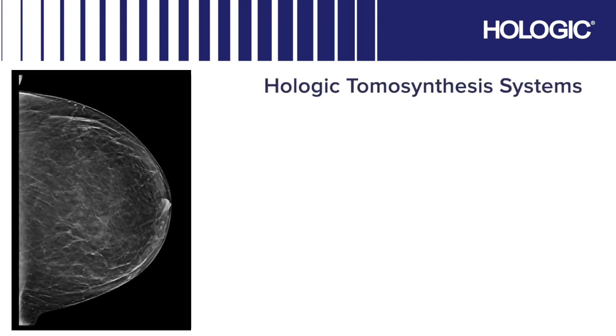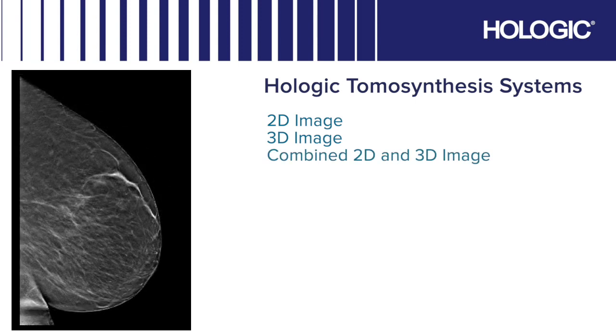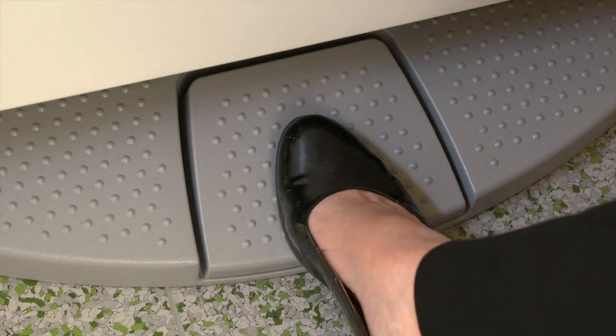The three dimensions can perform various examinations. We can do 2D images, 3D images, and a combined 2D and 3D image under the same compression. We can also perform tomo HD images which provide us with a 3D image and a synthetic 2D image. I'm now going to do a tomo examination.